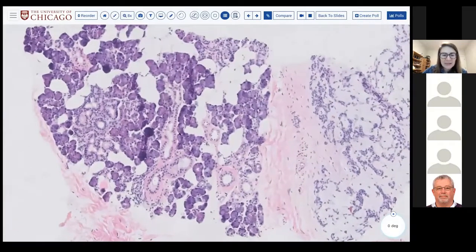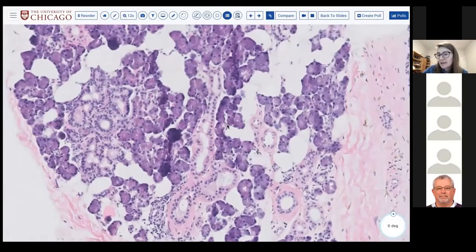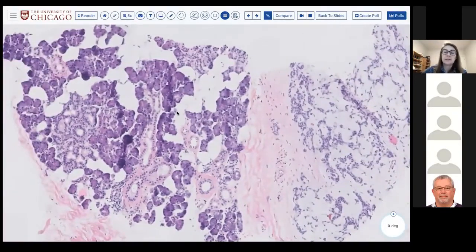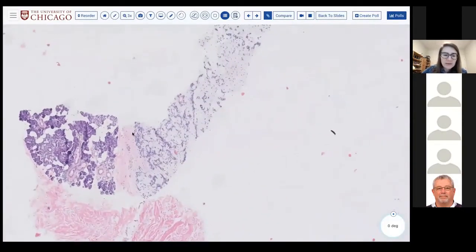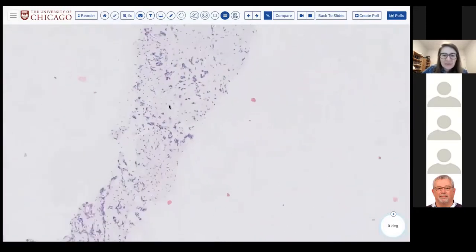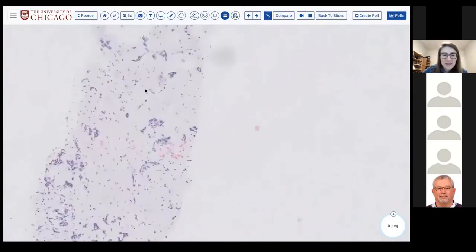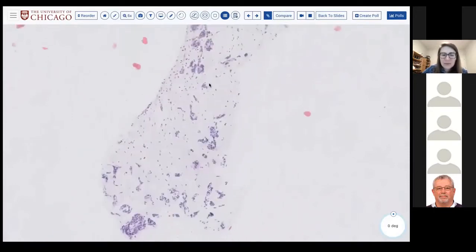And here in the surroundings, we have some purely serous salivary tissue with some ducts, so likely parotid. All right, so if we're dealing with seromucinous, we may be more likely to be in the submandibular, et cetera. Okay, so moving on to the lesion, you can see that there's a little bit of a clean border between the tumor and the parotid. Certainly, you've only sampled a fraction of the border, right? But if you look, the background stroma is very pale, very mucinous, or at least myxoid, and there are these strands of cells within the myxoid background. And so, you know, it's very paucicellular, with a myxoid background.